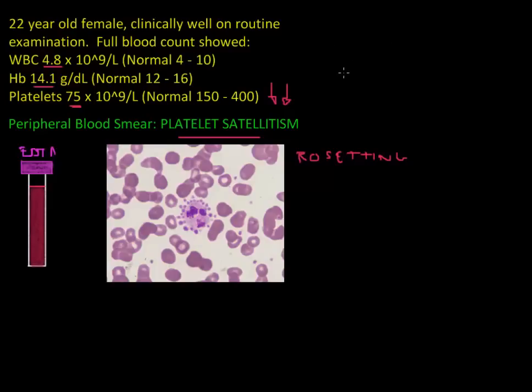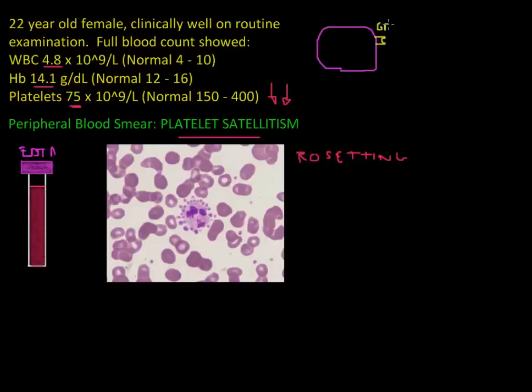Let's have a closer look at what happens to platelets when exposed to EDTA. Let's draw a platelet — on its surface there is an antigen, just a molecule, and in this case it is called glycoprotein 2b3a. That is the name of this molecule.